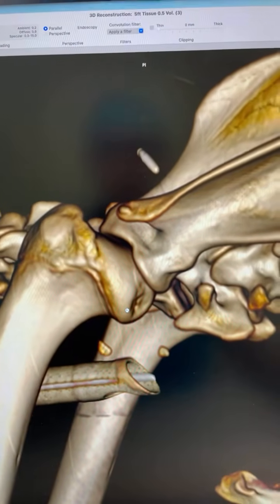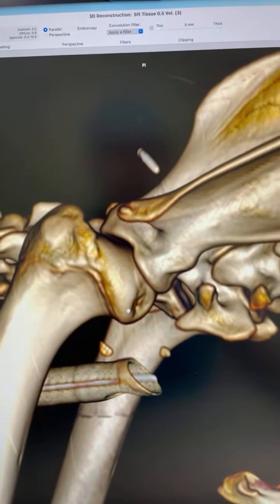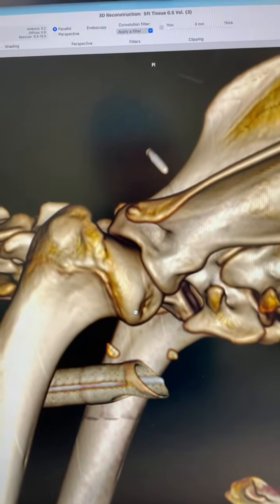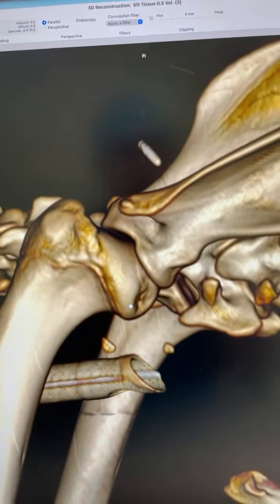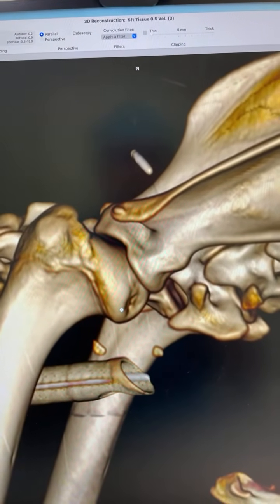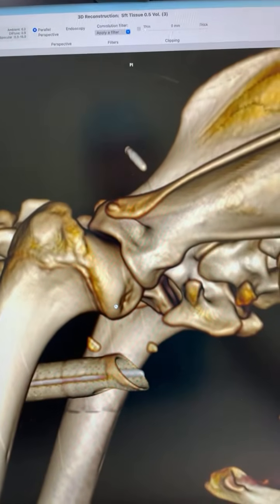Question, what kind of CT do we have? We have a Canon 16 slice or Toshiba 16 slice machine here in Moorabbin, and it's probably about 3 years old. And then we've got a 2-year-old Siemens 64 slice in Mornington.